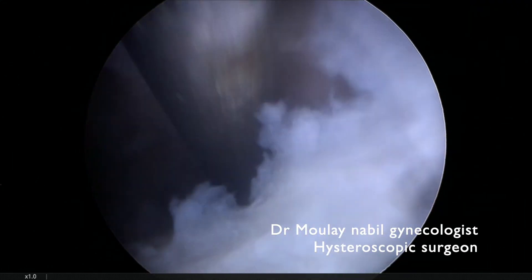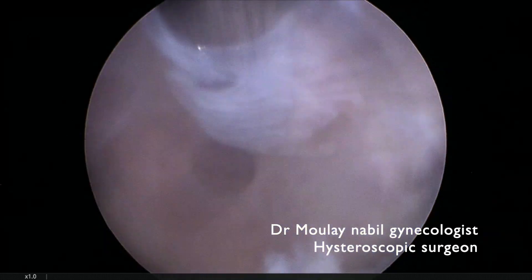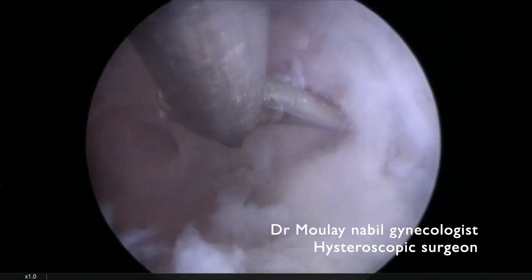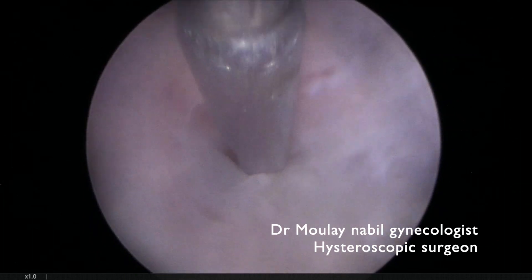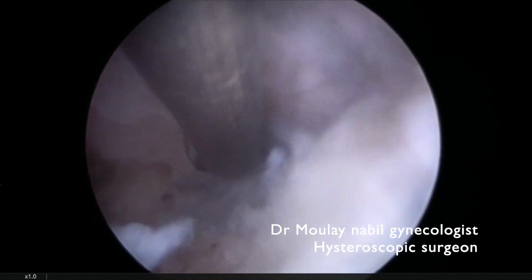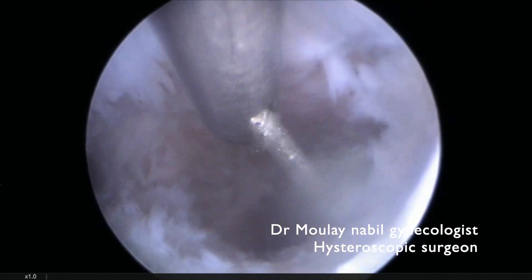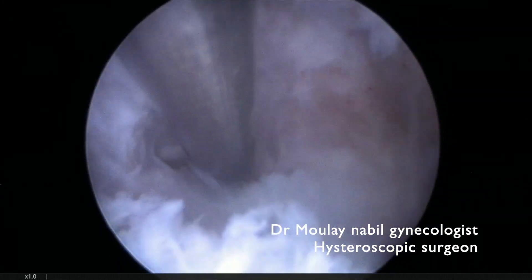We can see how dense these adhesions are. We see clearly our left tubal ostium. And now, we will rotate our cold scissor and begin the right section.